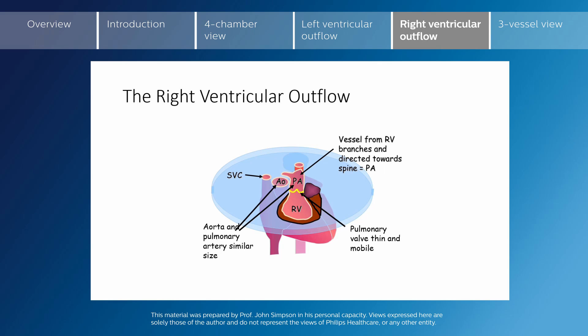The pulmonary valve should be thin and mobile, and a good way to assess this is by the fact that it cannot be seen during systole. It appears during diastole as it closes and disappears during systole.